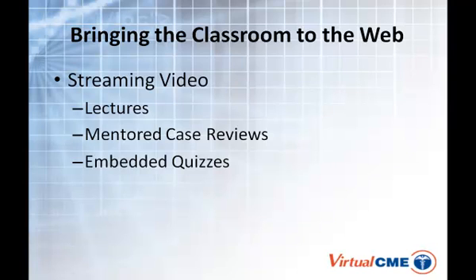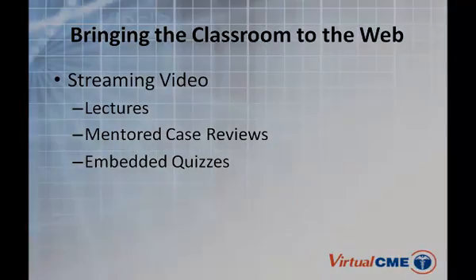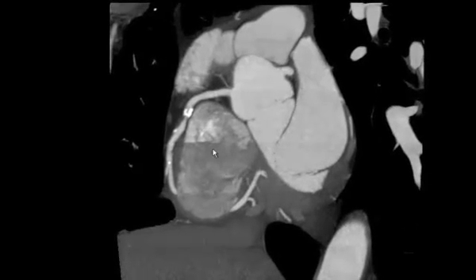The following is an example of case review. We'll now change orientation to the short axis view to look at the entirety of the strongly dominant right coronary artery here, and at the transition between the proximal and middle third, we see this complex area of plaque.